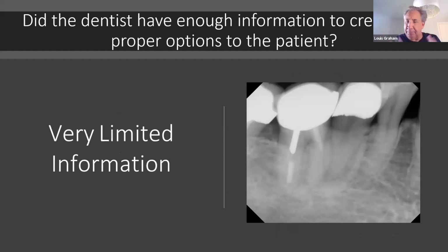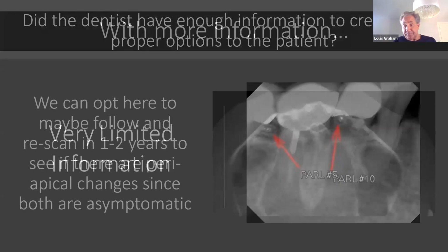I'm not placing any blame on the dentist downtown Chicago, but think of the cost of failure. This is how I started my course off. If he would have done 28 crowns on this patient or whatever number, and now you've got a short fill and you've got periapical pathology, you can't see it, and 29's got this issue, and he didn't see it. This is all going to be costly failure. And believe me, this has happened in my practice. This has happened in my career because I was using 2D imaging, and I was just guessing.